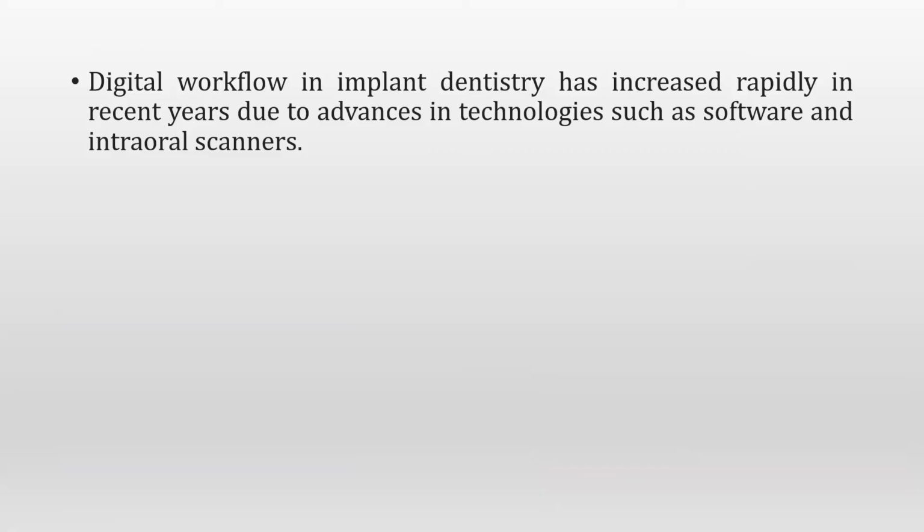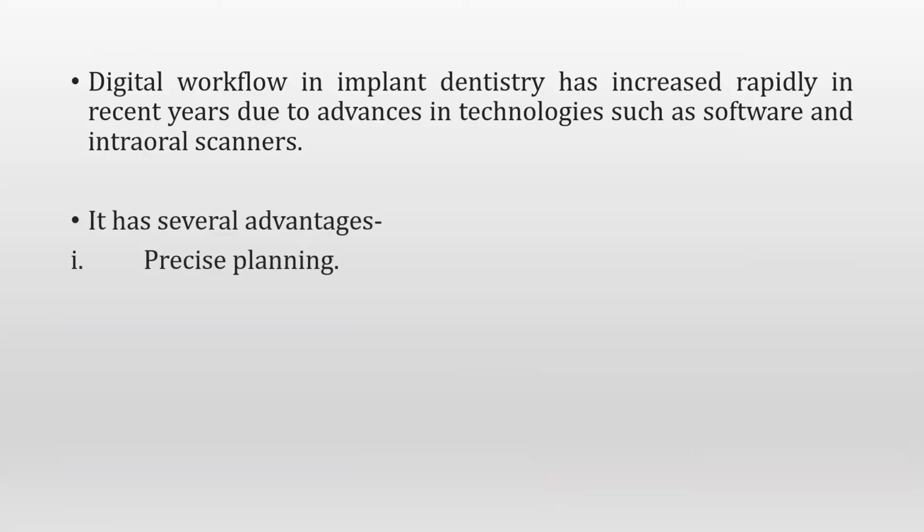So digital workflow in implant dentistry has increased rapidly in recent years due to the advances in technologies such as software and intraoral scanners. It has several advantages, like precise planning. It is said, if you fail to plan, you are planning to fail. So planning is the most important aspect of implant treatment, and that is a much easier job with the use of software.